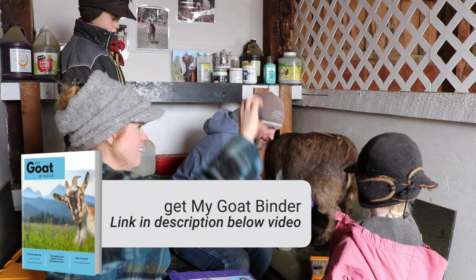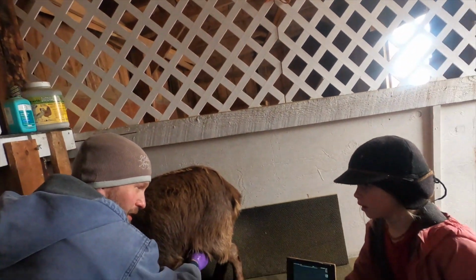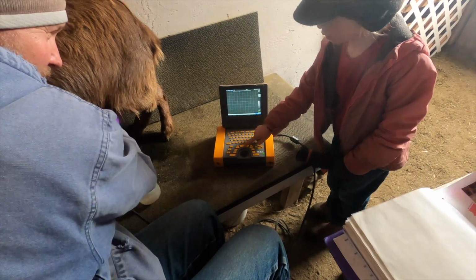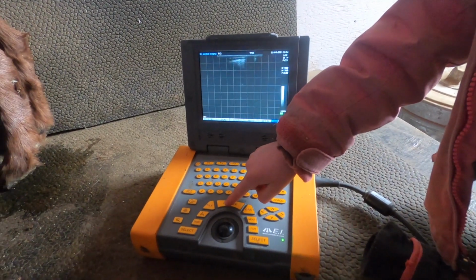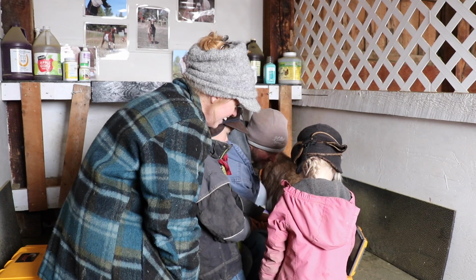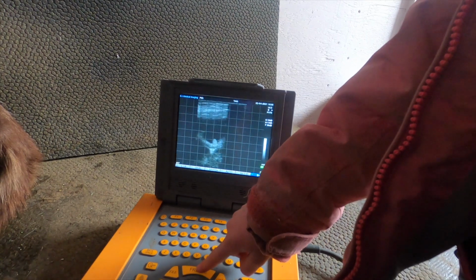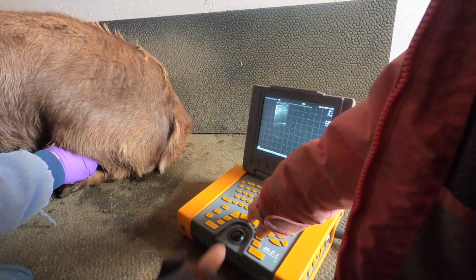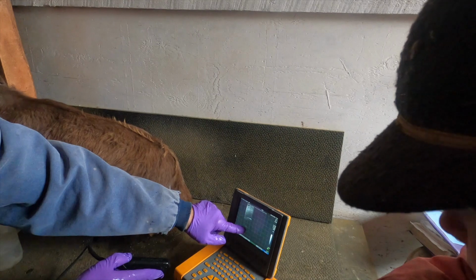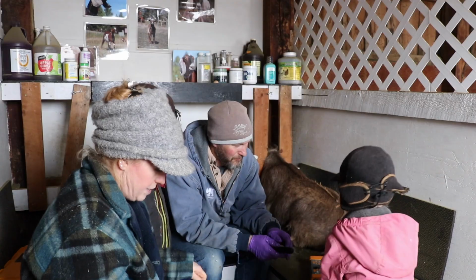Will you do me a favor? Put your finger right here, and when I tell you to push hard, I'm going to get a picture and you're going to freeze it for me. Ready? So she was bred on November 22nd, so it looks like April 21st is her due date. I keep getting a side view. I'm trying to get this head straight up and down so we can measure it and see how accurate the dates are. Push it. Good job. That's not a very good picture of the whole thing, but that's exactly what I need, that edge and that edge. So she's kind of on track. Cool. April 21st.